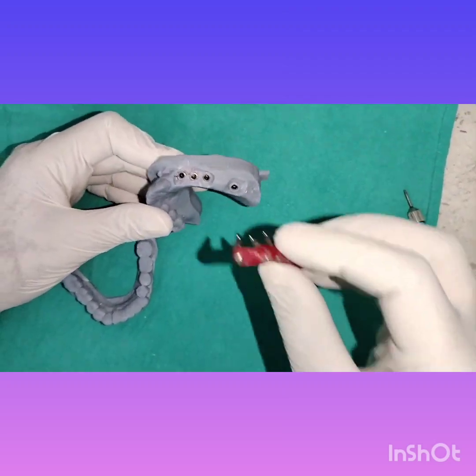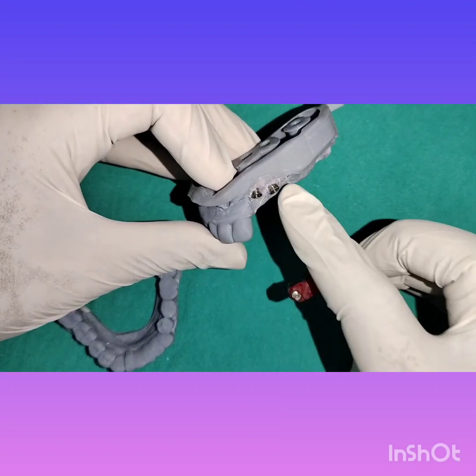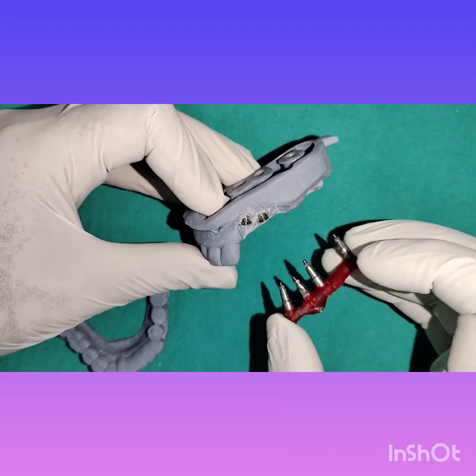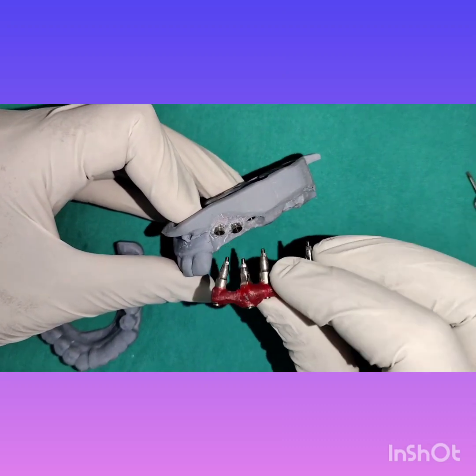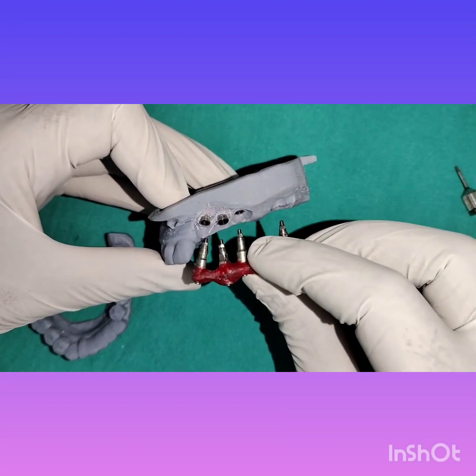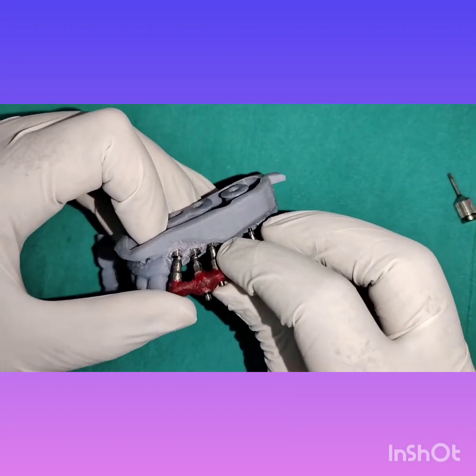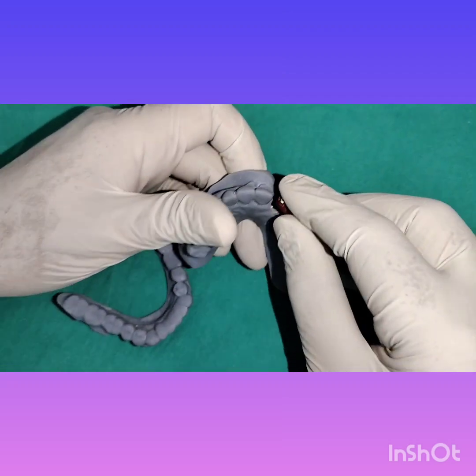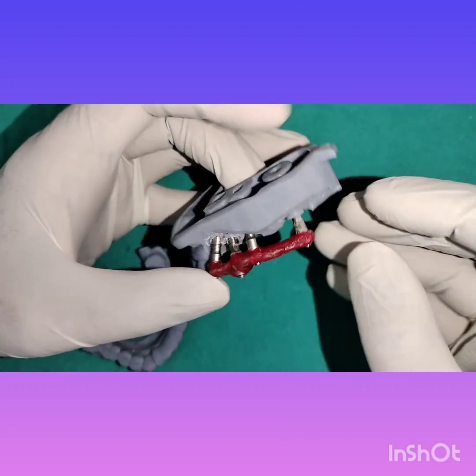Now we have the JIG trial and we have to do a JIG trial in the patient. Since we have seen the positioning — these two implants are quite buccally placed — when checking the JIG trial, first make sure you see what is the path of insertion of the JIG in the model itself. Position it here, because that is very important.